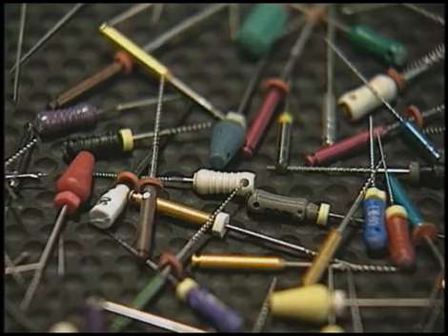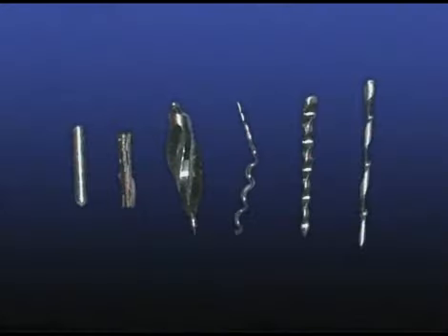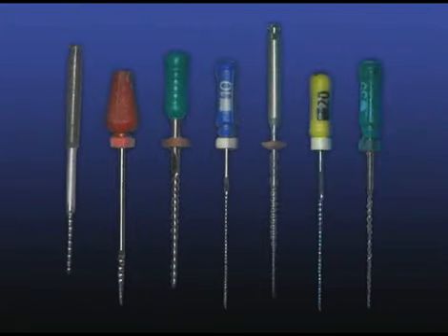Most clinicians would think of files when we say broken instruments, but the term also applies to the tip of a silver point, the core of a thermophil carrier, a Gates-Glidden burr, a Lentulus spiral, or any man-made obstruction left behind in the canal. This tape will deal mainly with files as obstructions since they are the most common offenders.